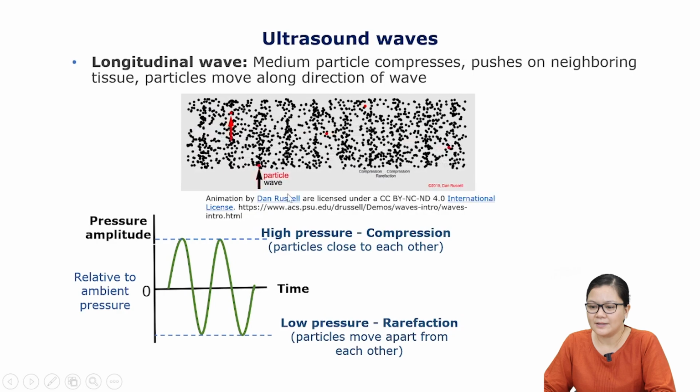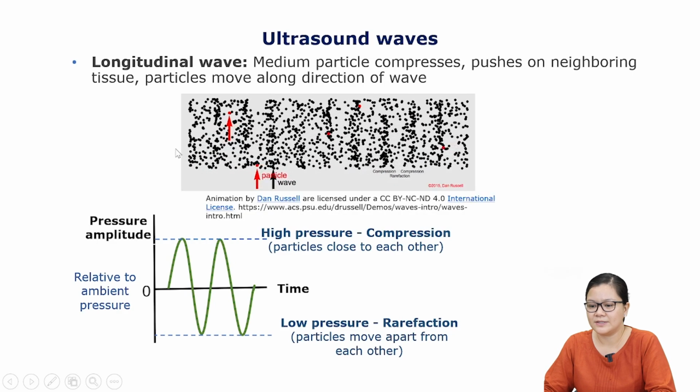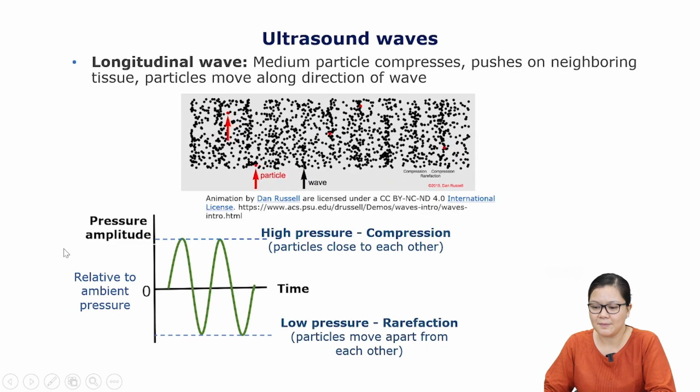Typically, these longitudinal waves are formed by generating some vibrations in the tissue. And you also have a detector on the other side, which is also a piezoelectric material. What you can observe from that detector is a type of waveform that looks like this. Typically in ultrasound imaging, the waveform is of a sinusoidal form like this, and we usually view it as a function of time.